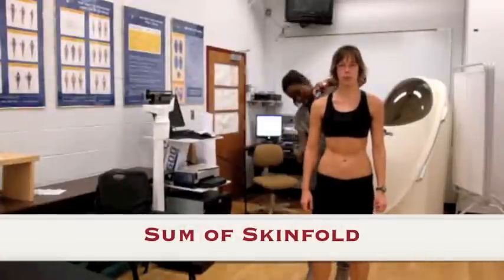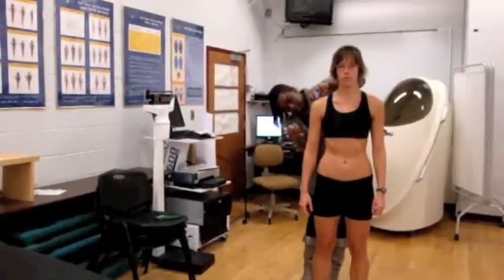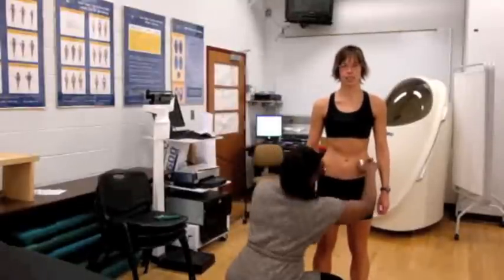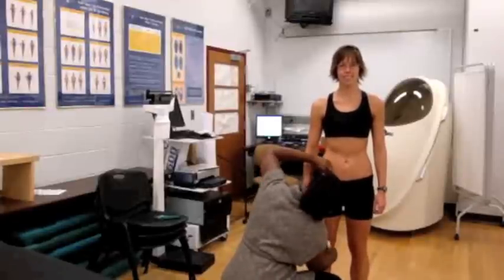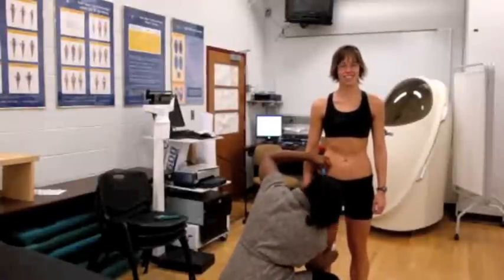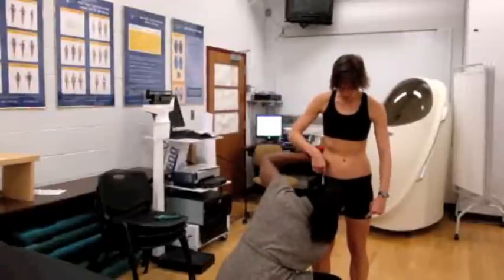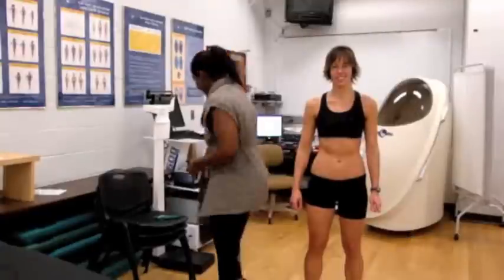The subcutaneous fat must be measured in a systematic way. Ensure that all the skin fold measurements are located on the right side of the body. All measurements will be taken in millimeters using skin fold calipers. Pick up the skin fold between the thumb and the index finger so as to include two thicknesses of skin and subcutaneous fat. Apply the calipers about one centimeter from the fingers at a depth equal to the thickness of the fold.